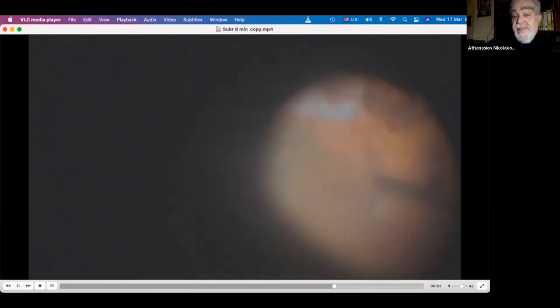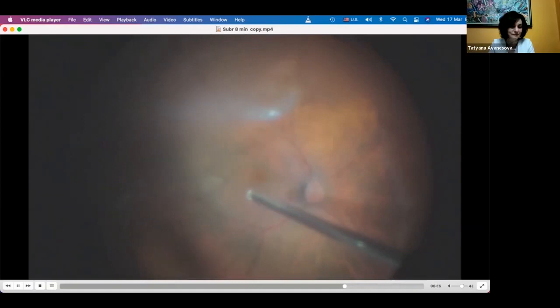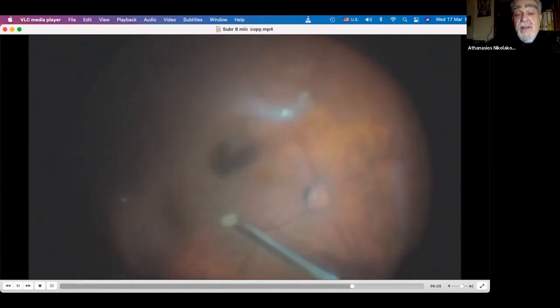And at the end, still using 23 gauge, we're using the force feeding method. I'm just going a little bit faster. You see at the end, we just try to make some pieces and remnants. Remember, it's a very hard nucleus. And that's the force feeding that I'm going to tell you, is that you need another hand for that. And you shouldn't look for it, it's going to come, and then you push it, and then you eat it.